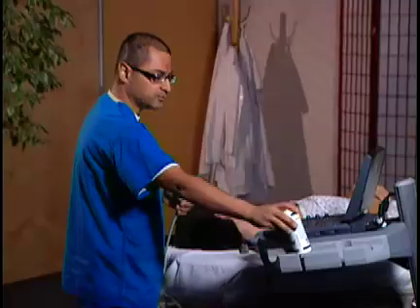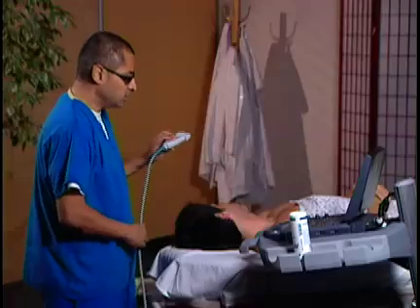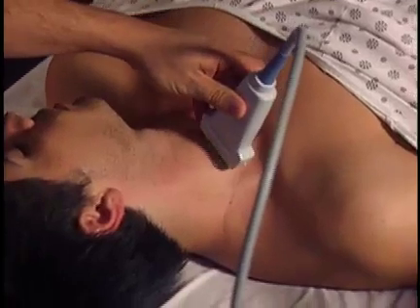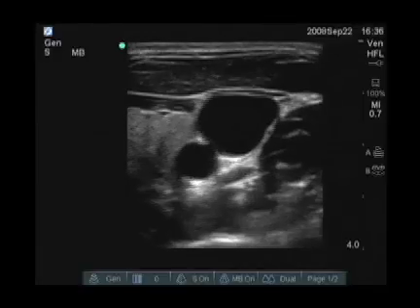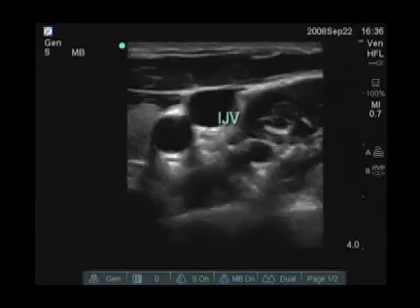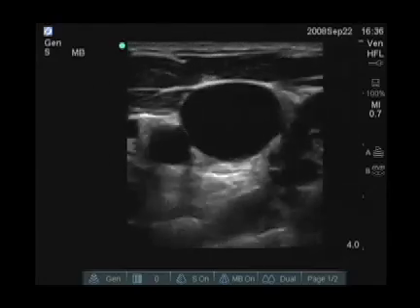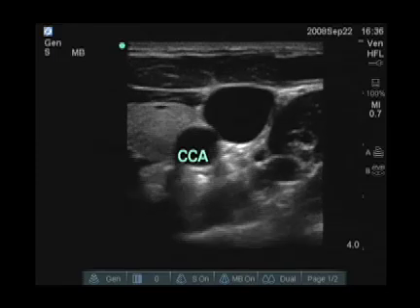I'm going to go ahead and put a little bit of gel on this transducer. Now let's take a look at his neck in the normal place where we would normally put our needle. Looking at the screen, in the center is a very large anechoic structure, and you can see that it easily collapses. This is the jugular vein. Just adjacent to this, to the left of the screen and below the vein, is the artery.